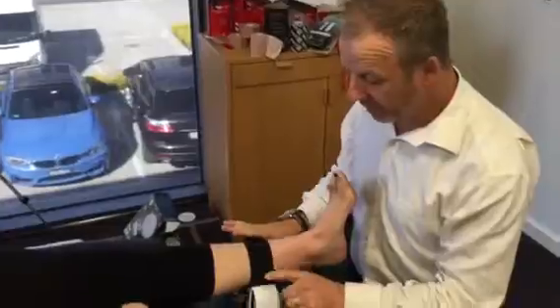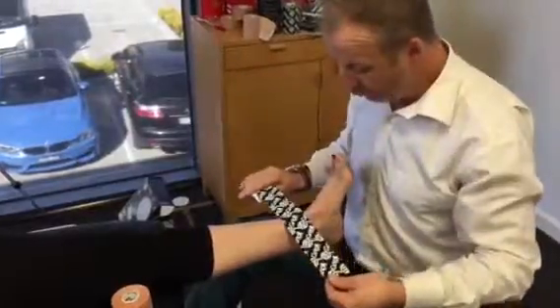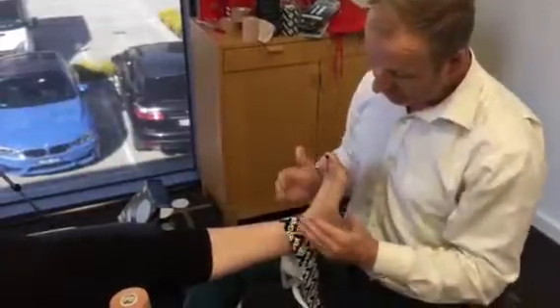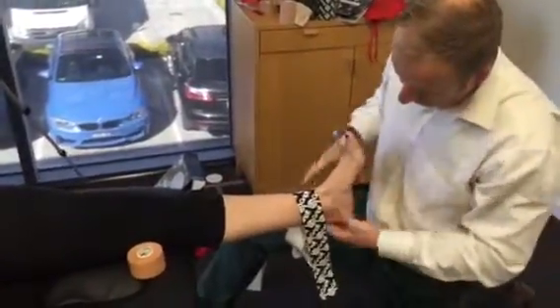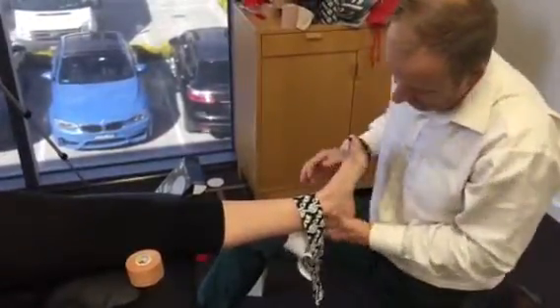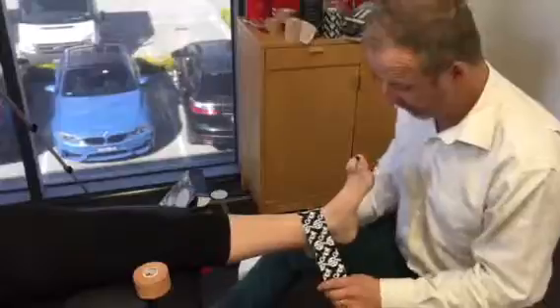We've got a three-layer technique here — three layers on top of each other. Nylon's quite smooth, so you can triple the layers. What we're going to do is try to stop this bone here moving forward. We need to somehow leverage this against the bone it moves forward on, which is the talus. The talus and the calcaneum, everything together — we can get the talus, the subtalar joint, and the calcaneum all to hold together to try and stop that moving forward, almost pushing the tibia back.